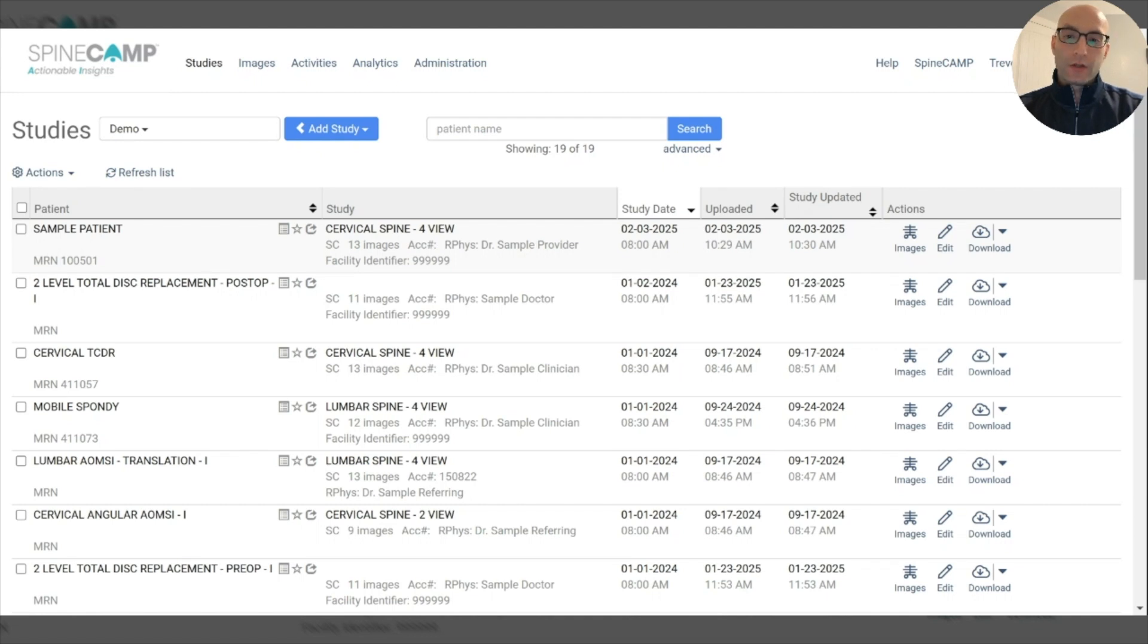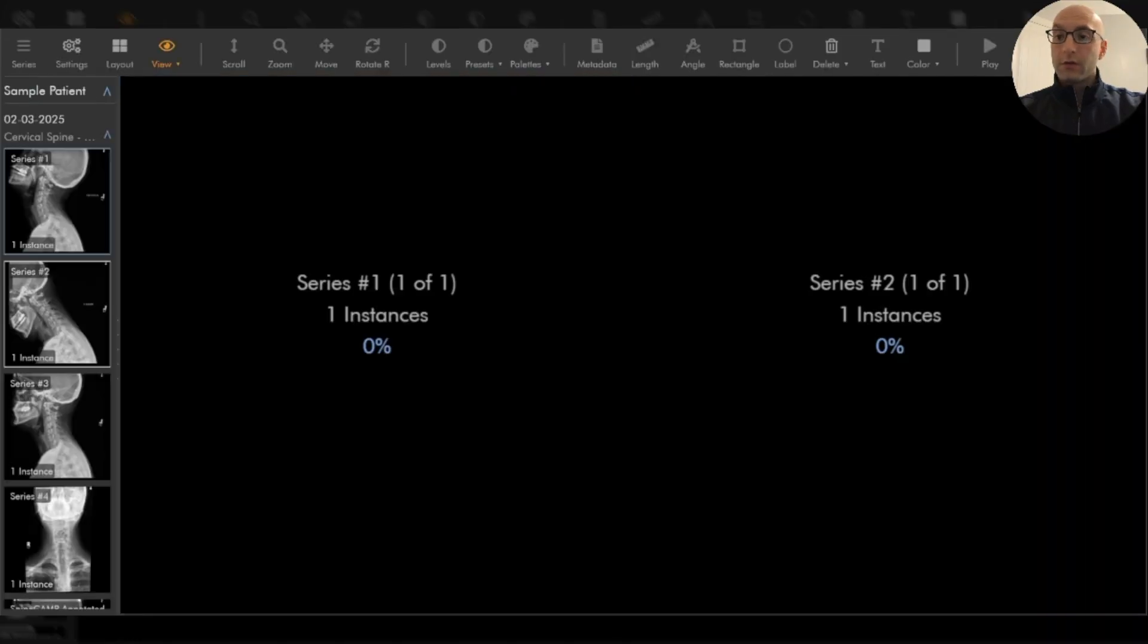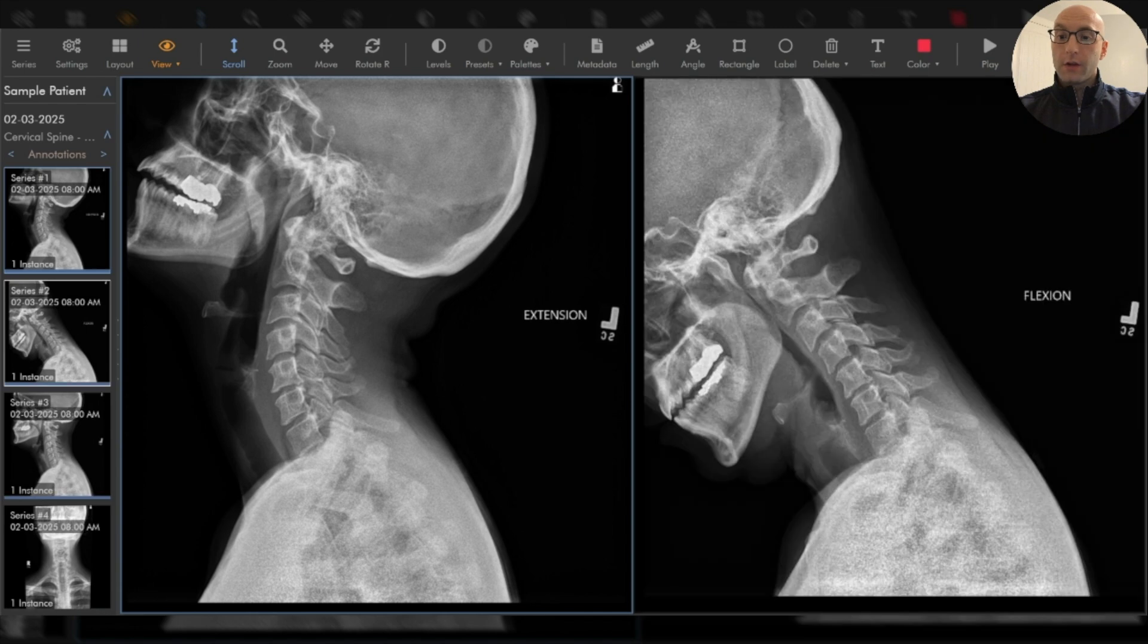This technology is FDA 510k cleared for cervical and lumbar spine. All you need to do is upload your standard of care x-rays to this platform and you'll get results back in a couple of seconds. Let's take a look and see what this looks like.